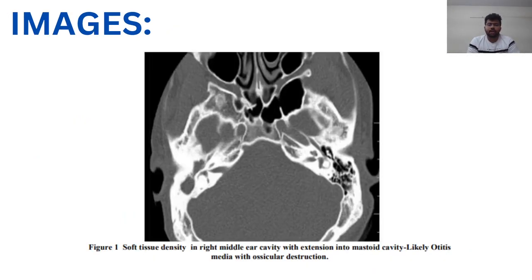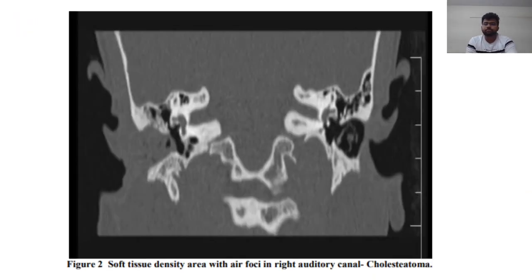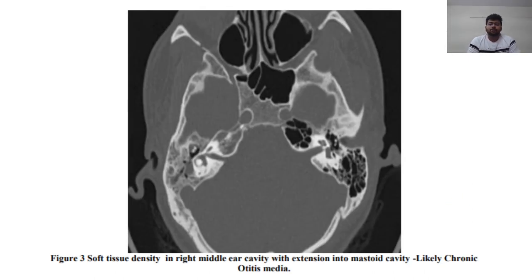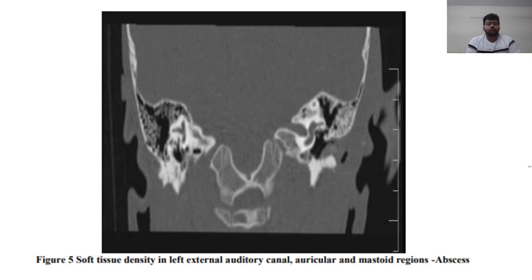Here are a few image examples from our study. The first shows soft tissue density in the right middle ear cavity with extension into the mastoid cavity, consistent with otitis media with ossicular chain disruption. The second shows soft tissue density with air foci in the right auditory canal, likely a cholesteatoma. Another case shows soft tissue density in the right middle ear cavity extending into the mastoid cavity, likely chronic otitis media. One case shows soft tissue density in the right mastoid air cells only, consistent with mastoiditis. Finally, soft tissue density in the left external auditory canal, auricular, and mastoid regions turned out to be an abscess.